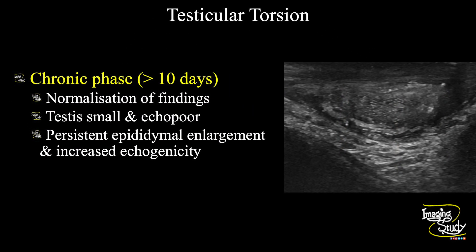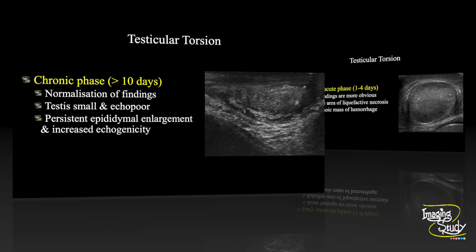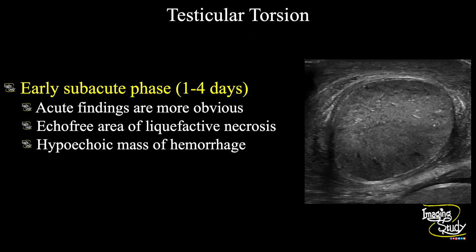In the chronic phase, the features will get normalized. The testes will get small and echopoor, and the epididymis may show persistent enlargement with increased echogenicity. Our case was of the early sub-acute phase.